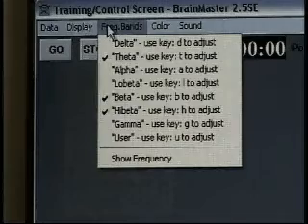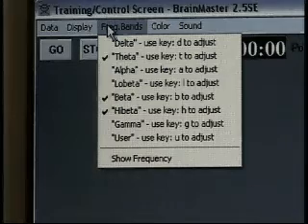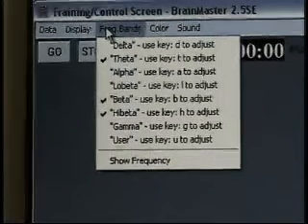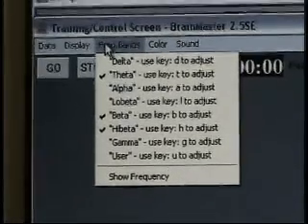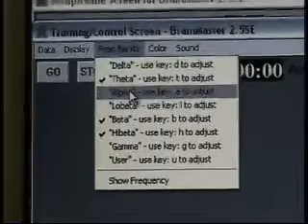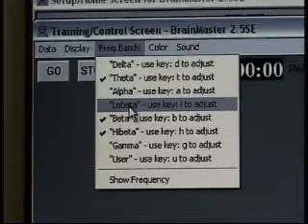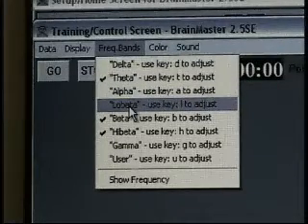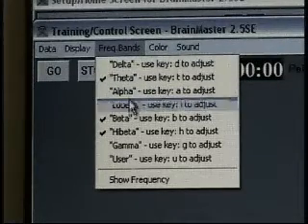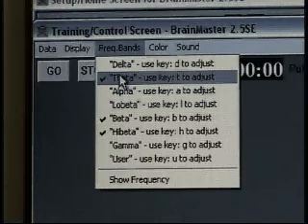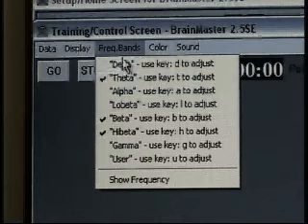The next option is Frequency Bands. These are the frequency bands that we've selected to see on the panels. As I had mentioned before, we can look at alpha or low beta even though we're ignoring them for feedback. This allows you to turn them on or off from the training screen.